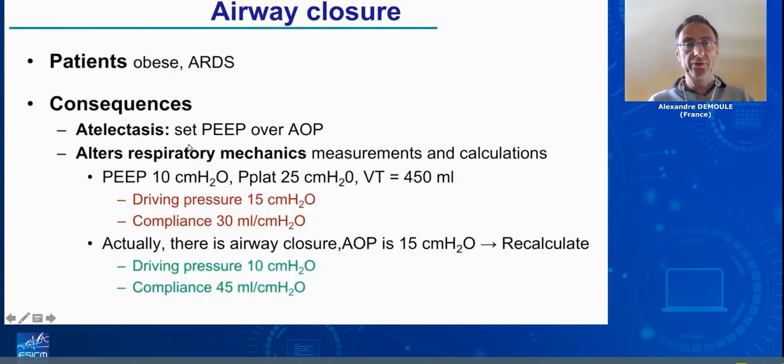Why is that important? First, it's quite common in obese patients: 30 to 60% of obese patients have airway closure. And also ARDS patients, 25% of patients. It's very important because it creates atelectasis. And then we should set PEEP over the airway opening pressure.